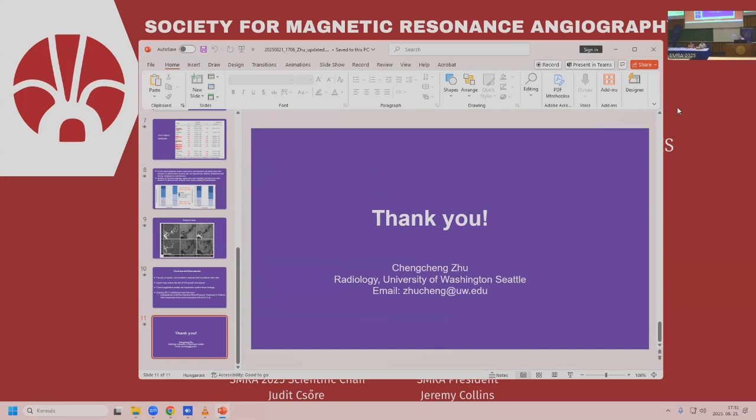So I think that's a limitation of the study because it's a multi-center study in more than 80 medical centers. Although we have the MSDE or DANTE, the technique is very hard to implement in every hospital, so we have to use the product sequence. We do see some flow artifacts, so we can still measure the enhancement, but it's hard to know whether that's artifacts or true enhancement. That's a limitation.